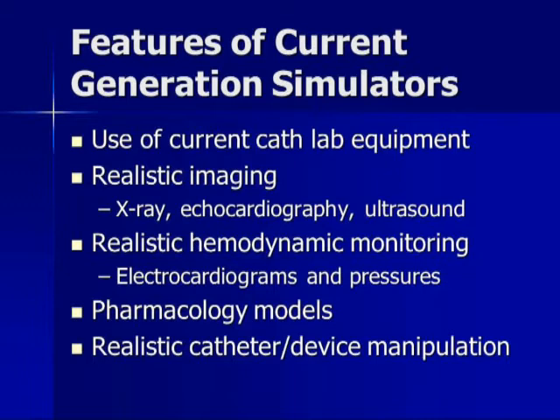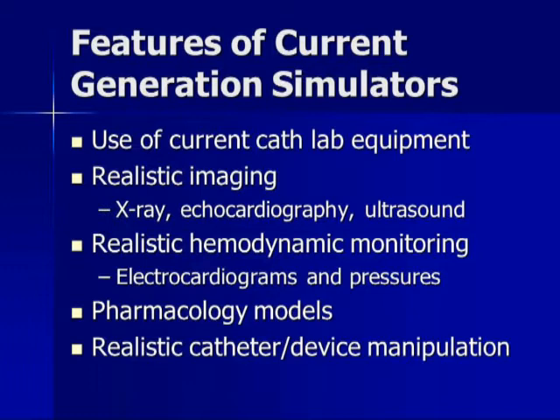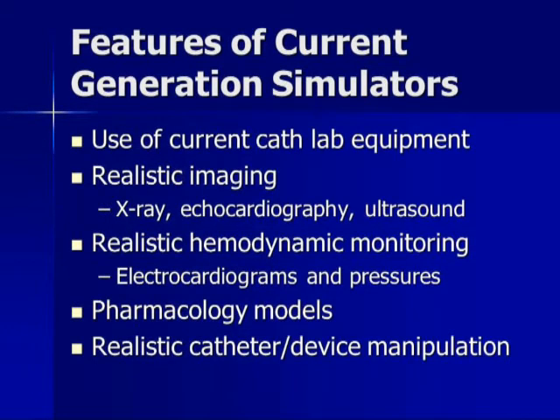ultrasound imaging, which we use pretty routinely now, and CT and MR imaging into these so that people can work on their visuospatial skills and three-dimensional skills as well. The hemodynamic monitoring is pretty part and parcel, and all the companies do a great job of integrating that. There are full pharmacology models in all of these simulators. If you give drug A, and drug A is a good drug, it helps your problem. If you give drug B, and drug B is a bad drug, or you give a log dose error, there are catastrophic consequences for the patient. These are great ways of tracking some of these complications in decision making, much like the epinephrine story that was talked about earlier.